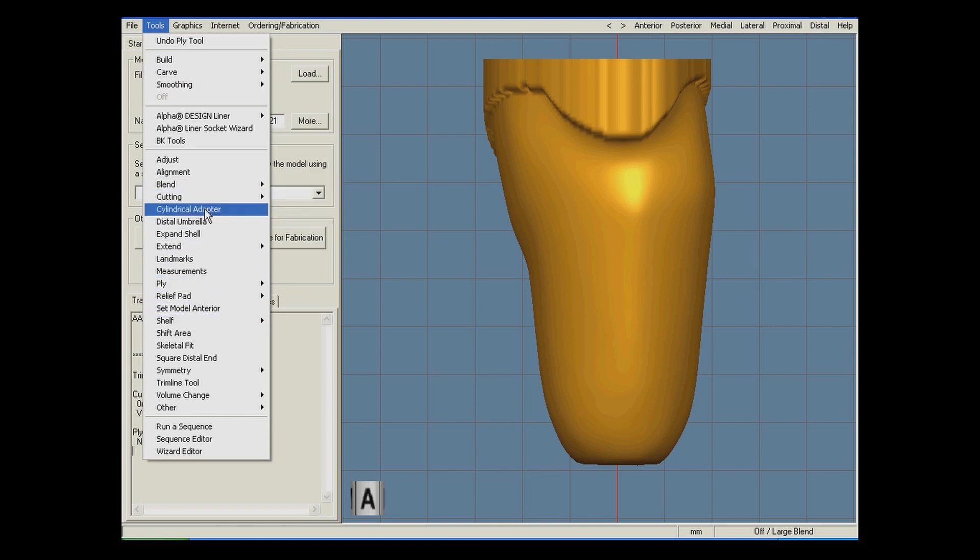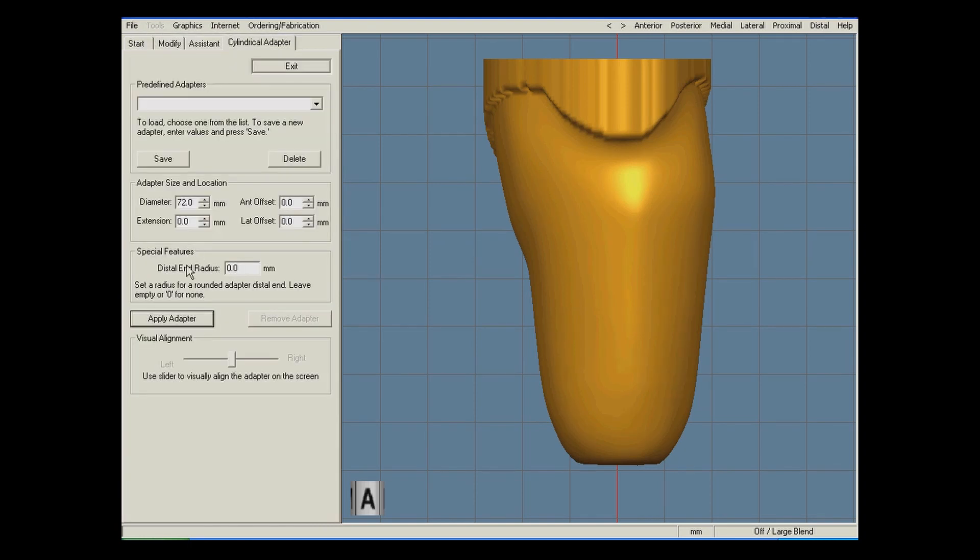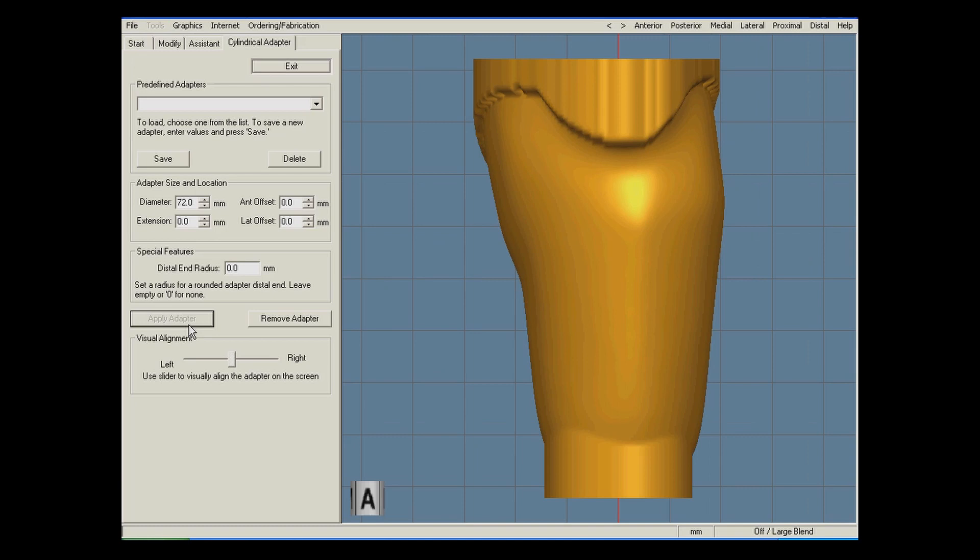Then, I will use the cylindrical adapter tool to help align the socket into its final position. It is important to note that the alignment should be done by moving the socket, never moving the cylindrical adapter.